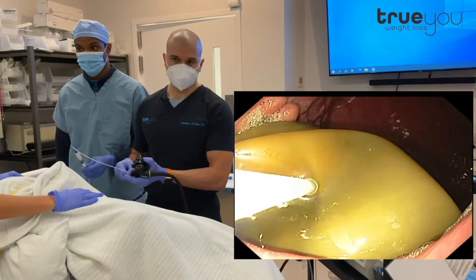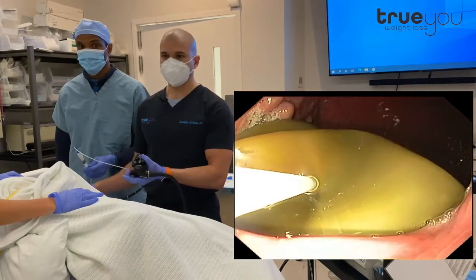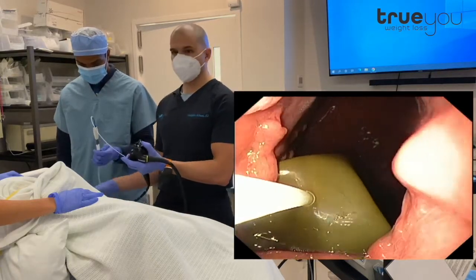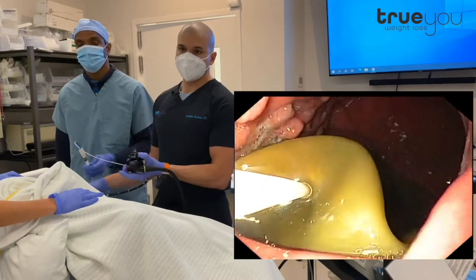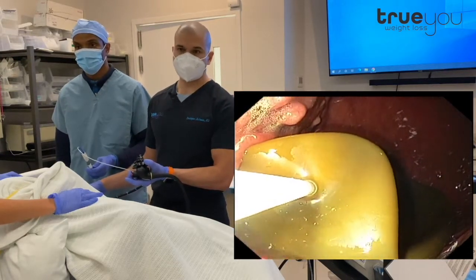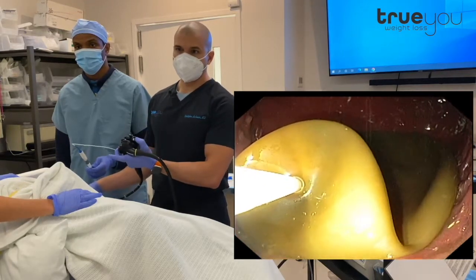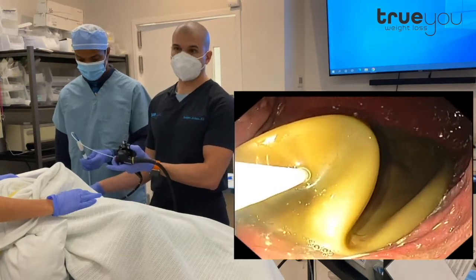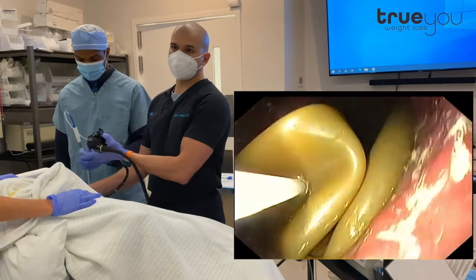The risk of any kind of complication from this procedure — from having the balloon — is less than 1 in 1,000, or 1 in 10,000 for anything serious to occur. So this is almost empty. It's still flowing. This is connected to suction — wall suction — and it's just pulling the fluid right out. This balloon is filled with approximately 550 cc's of saline, so that's what we're taking out. Once it's empty, you will see the edges on the balloon — we know it's completely empty — and it will stop flowing. And you'll see the whole balloon collapse. The stomach is otherwise completely healthy.